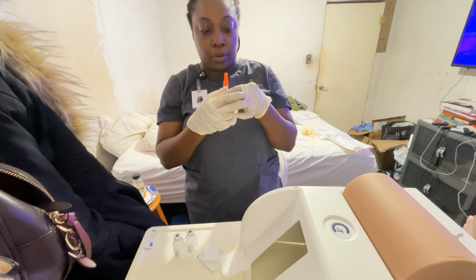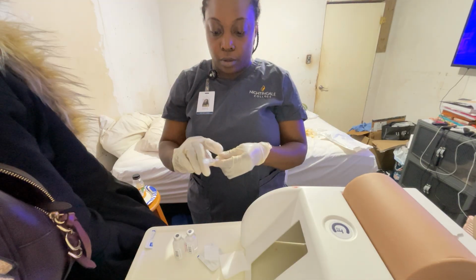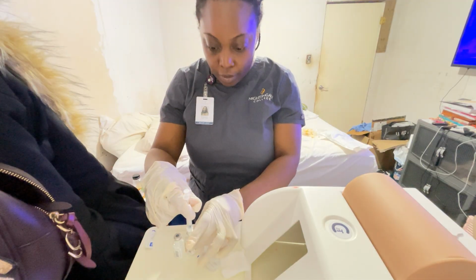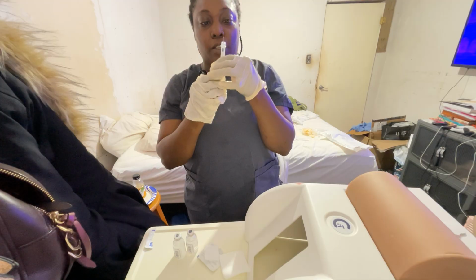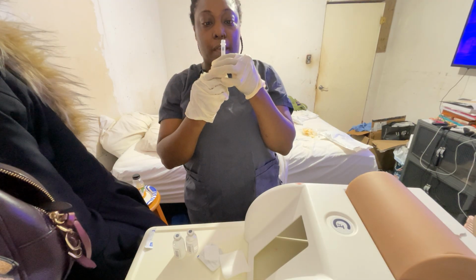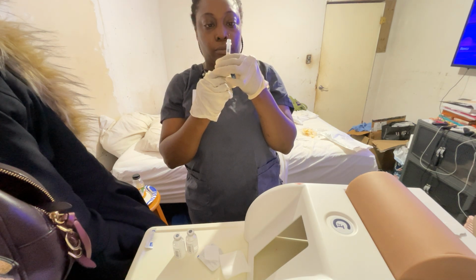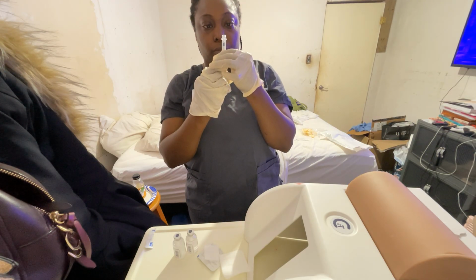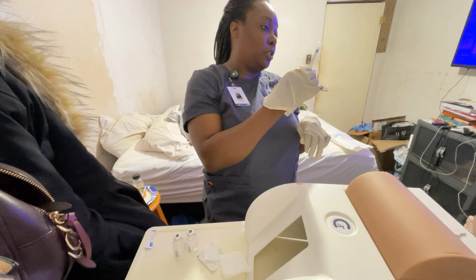Safety off. Move the needle. Check 4 units. Now I'm also going to pull up another 8 units of air. See, there's 8 units there.